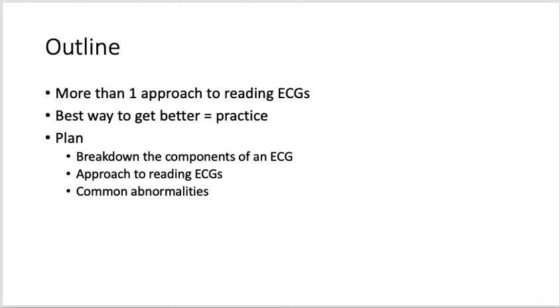I think it's incredibly important to have a system to follow. With whichever one you choose, I'm going to stick with that technique so you can be systematic in your approach. This will help to make sure you don't miss any critical steps. It will also help to make it easier for you when you get an ECG shoved in your face while on rounds with the consultants. You get asked to interpret it.